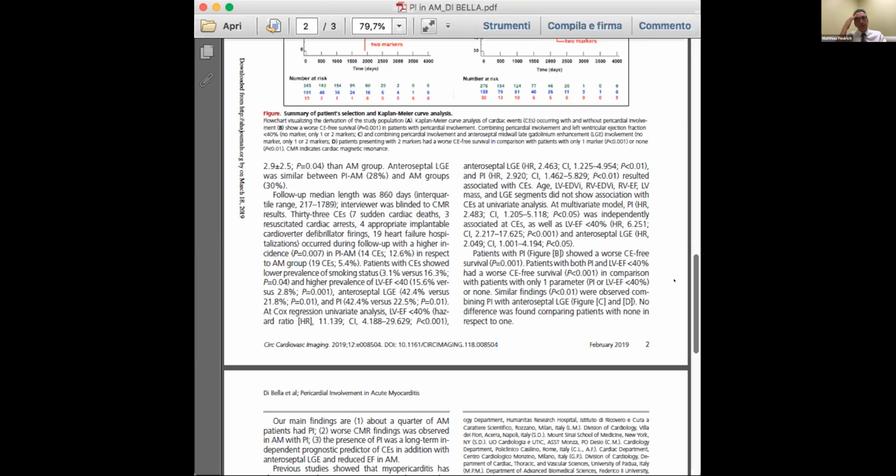So you defined pericardial inflammation as hyperintensity on T2 weighted images. But you said 50%. So the clinical experience is not so much the 50%, but that's just a yes or no. So you said 5 millimeters, and then the 50% hyperintensity, is that really on both T2 and late gadolinium enhancement, or is the 50% more for the late gadolinium enhancement? Just for the definition of pericardial involvement.